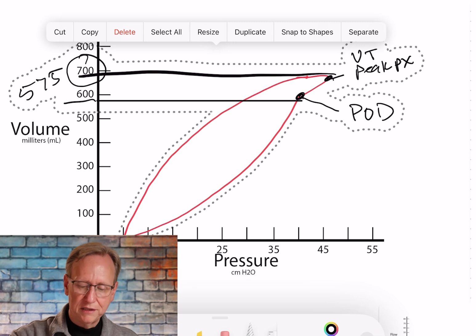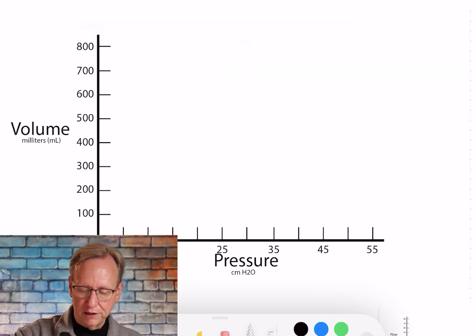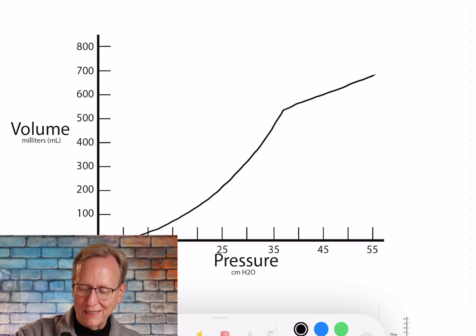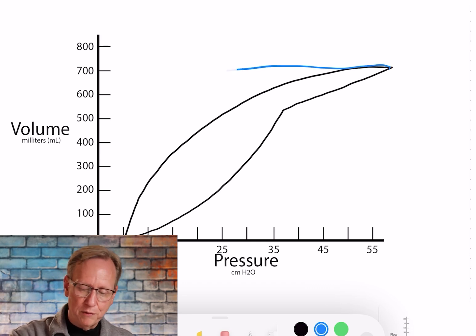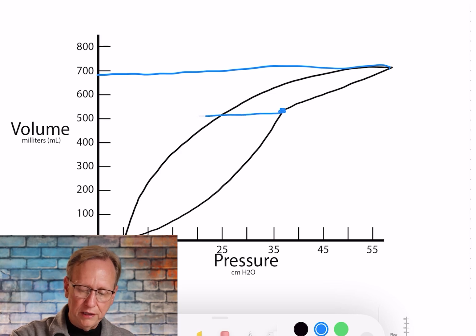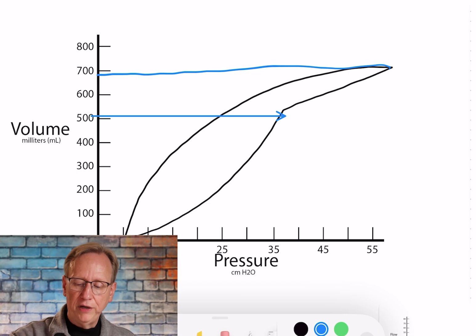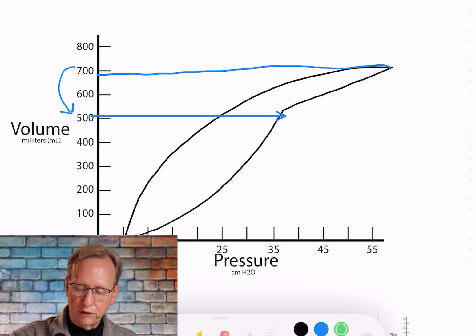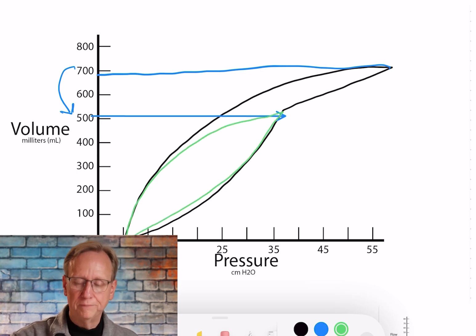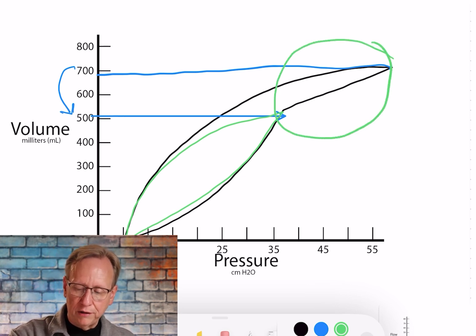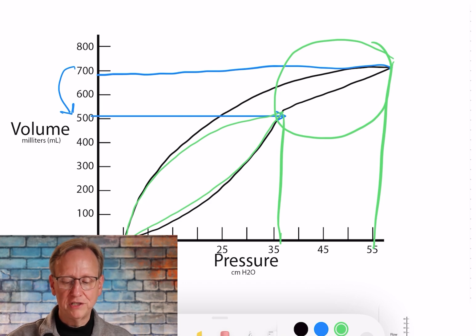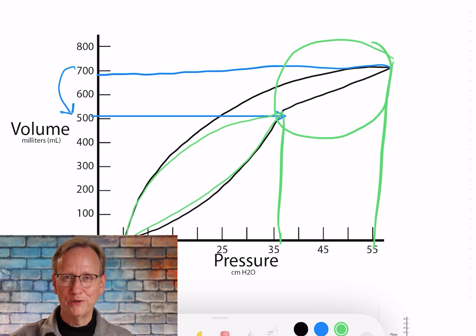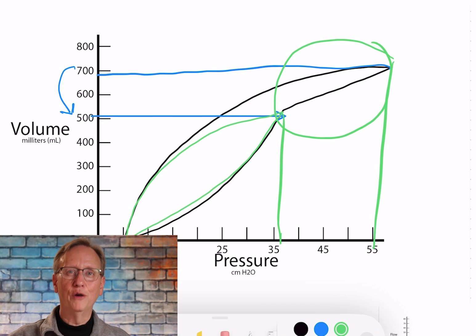A small beak might be acceptable in some scenarios, but a large, gigantic beak is never good. If the patient is set at a tidal volume of 700 but the point of over-distension says they should be at 500, lowering the tidal volume from 700 to 500 produces a normal-looking loop. That eliminates a large portion of the graph that was nearly doubling the pressure exposure, reducing barotrauma risk and other baro-related complications significantly.